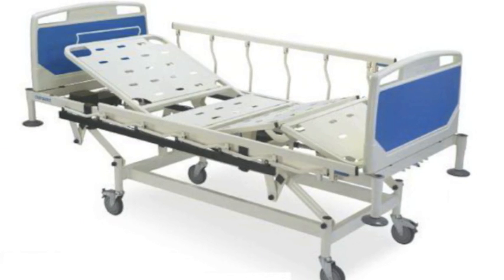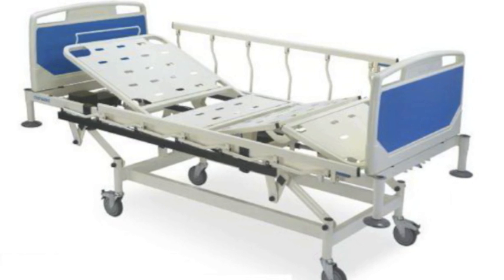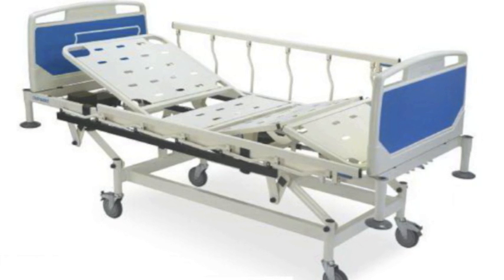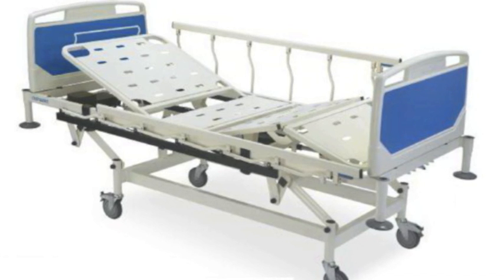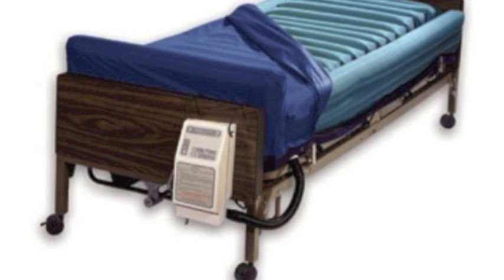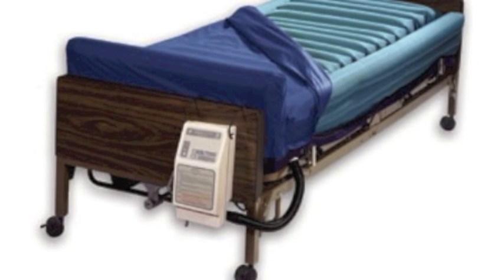These mattresses function as a separate unit than the existing mattress on the bed. Therefore, the existing mattress must be removed prior to setting up the low air loss mattress. First, place the protective mattress cover over the bed so that the air hole which the pump will attach to is at the foot of the bed.